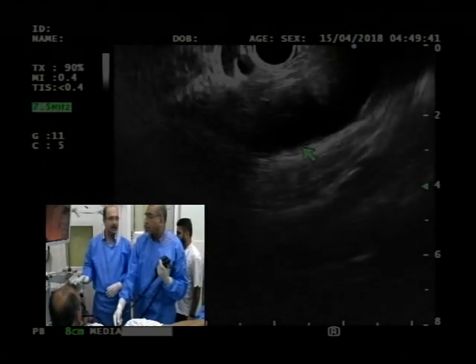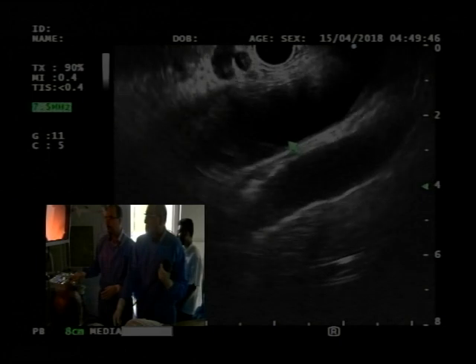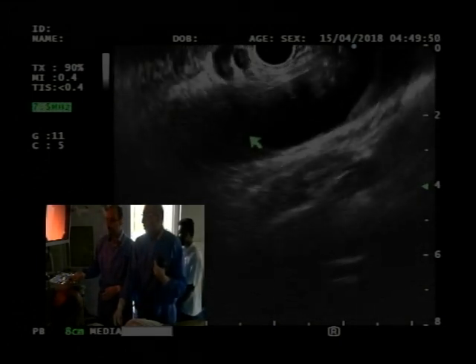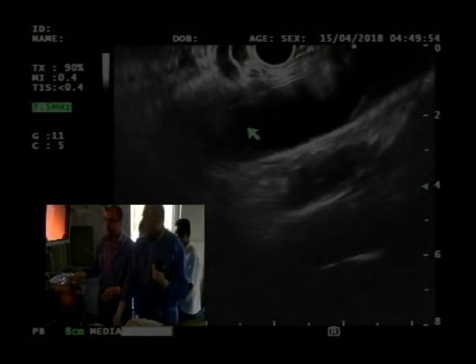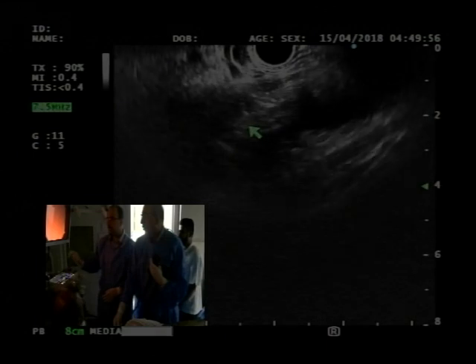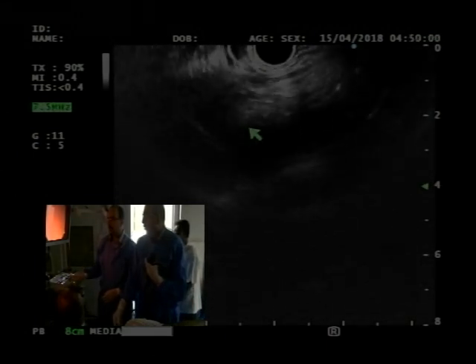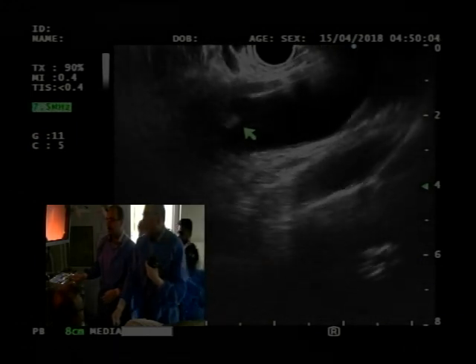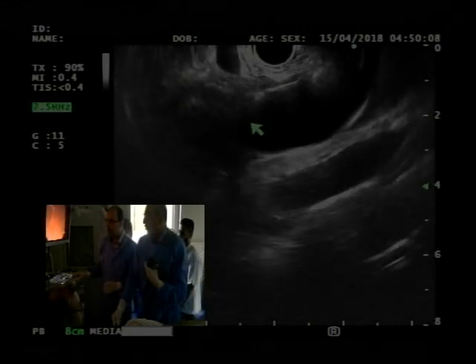Yeah. Okay. So what has happened? What's this? Okay, fine. Now push, advance your scope a bit and spin over the aorta. Keep the aorta in view. So what you want to do is spin so that you don't lose sight of the aorta. Okay, fine. Now what's this? There you go. What's this now? Celiac. Okay, I'm going to freeze it for one second.